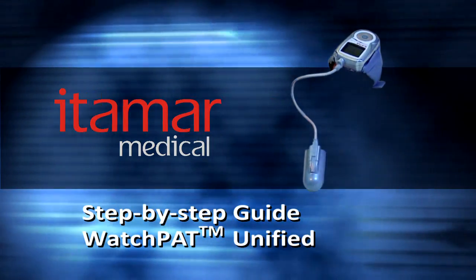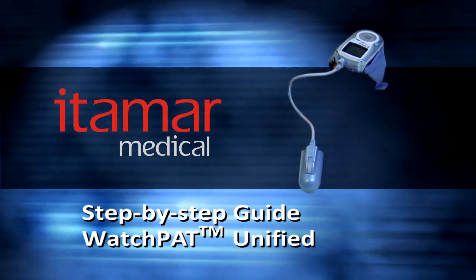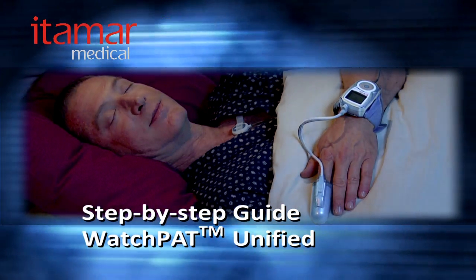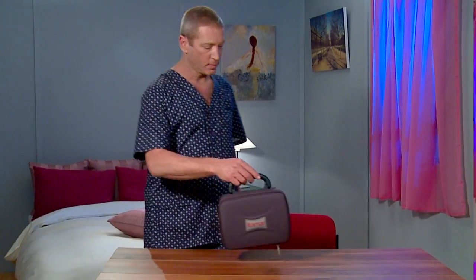This brief video will show you how to correctly put on and use the WatchPat sleep diagnostic device. You should put the WatchPat device on when you are already in your pajamas, just before getting into bed.